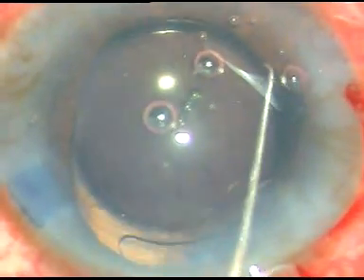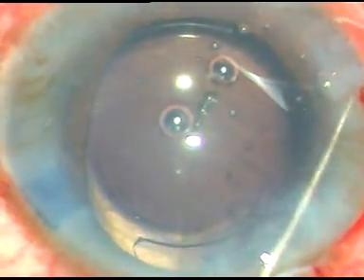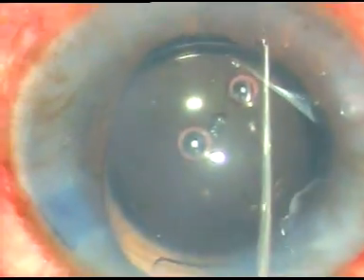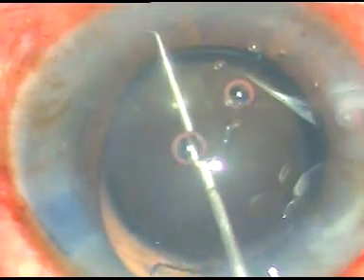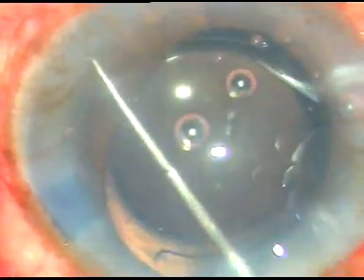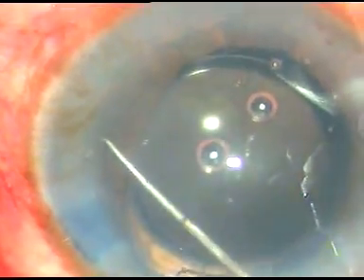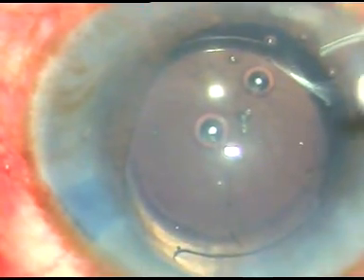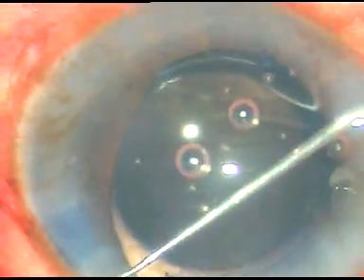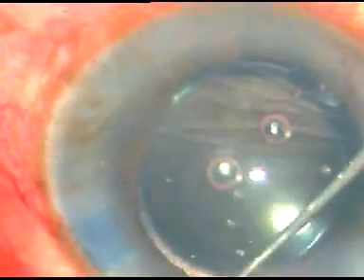I am pulling the iris. The iris actually has dilated and it has gone to the angle. The root of the iris is actually clumped and it has blocked the angle, and there is no drainage of aqueous humor.